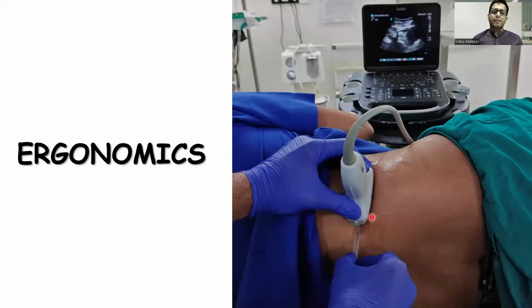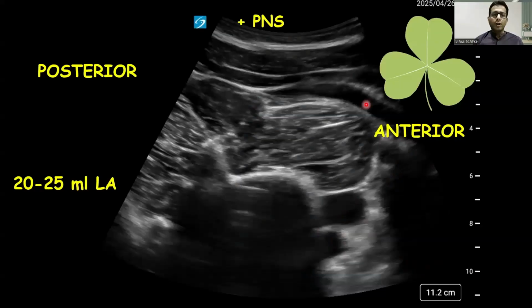Ergonomics: for the lumbar plexus, we need to put the patient in the lateral position, with the site to be blocked above. And as we can see, the person performing the block, the patient, and the machine have to be in a straight line always, because ergonomics are of very much importance. Now coming to the first view, the Shamrock sign.